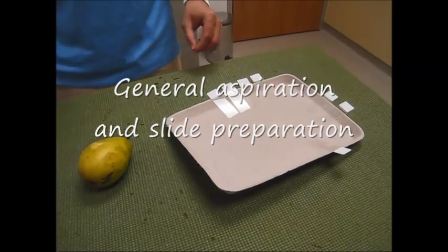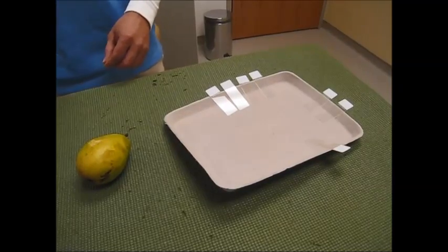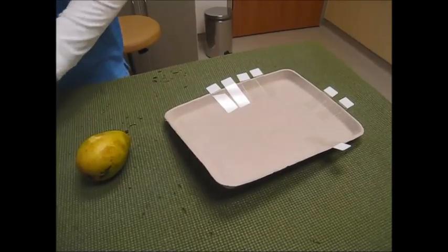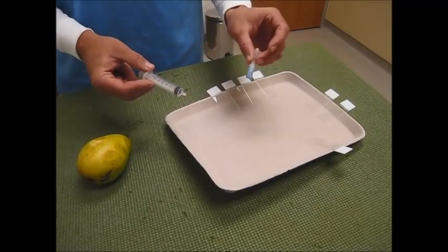First, start out by laying out three or four slides that you're going to spray your aspirated material on. Next, you will need a 22 gauge needle and a 6 or 12 cc syringe.